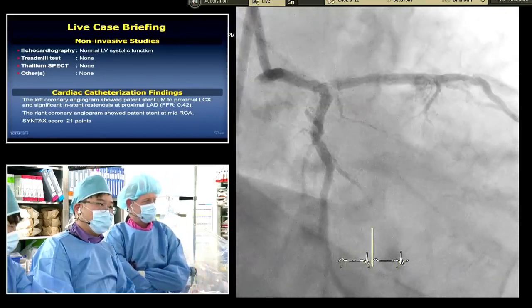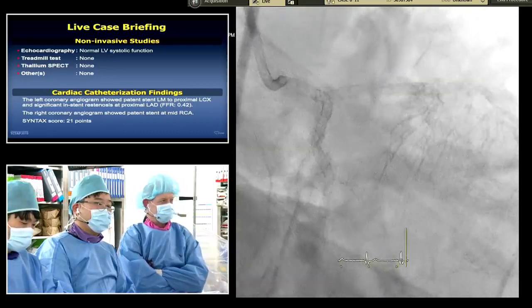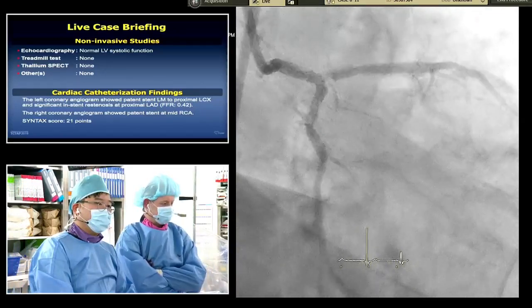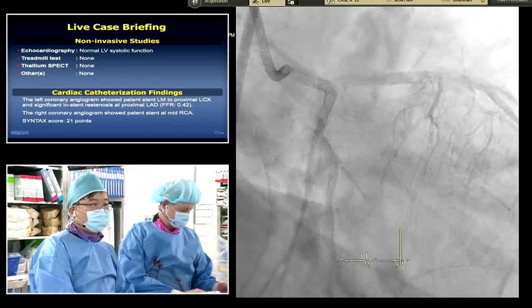Yeah. You know, you don't have the three diameters there. You have in left main the same diameter as this insert, and this is not three diameters. So maybe it is a factor of restenosis at the ostium of the LAD. And now we have already two layers in the LAD. It will be very difficult to stent the LAD.